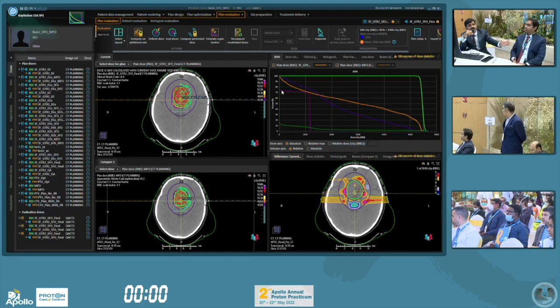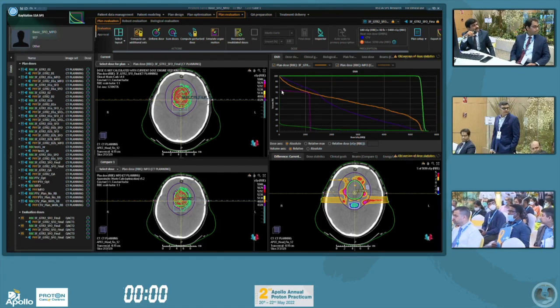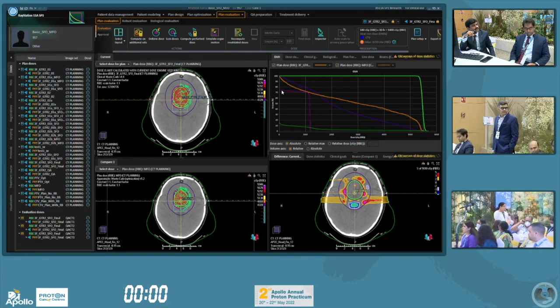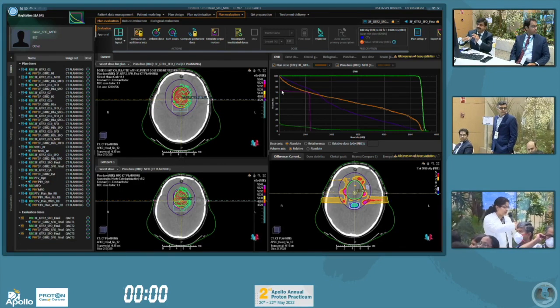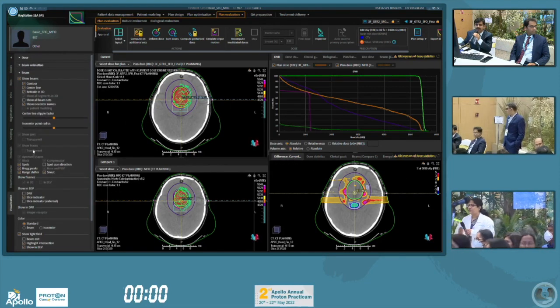So I think the evaluation part is going to be done by my colleague Karthik. He's going to explain. Yeah, I think the evaluation part will answer your question of whether you can use the PTV to evaluate your plan while optimizing on the CTV. So that is covered a little bit.